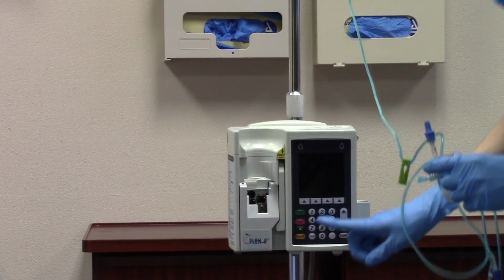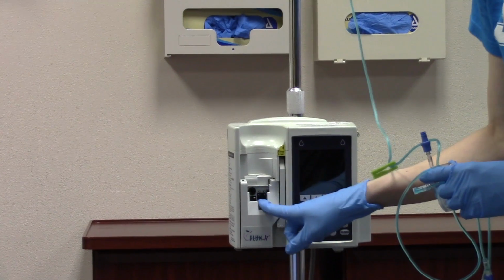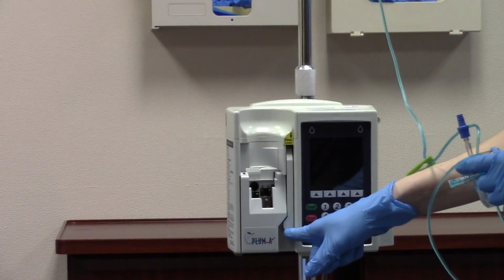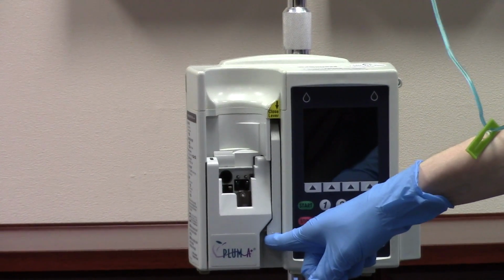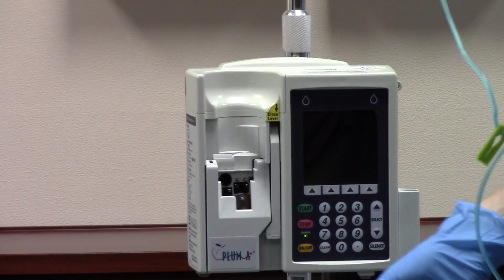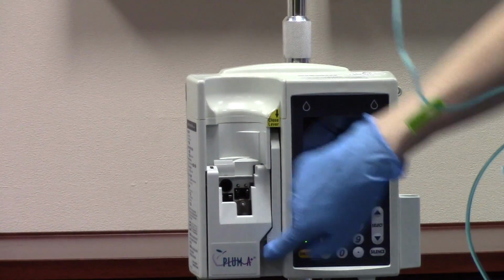For this pump, the Plum pump, this is where the cartridge goes, and there is a lever right here that says pull. Please pull where it says pull. Don't pull anywhere else on here because you will tear up the pump. Where it says pull, pull.